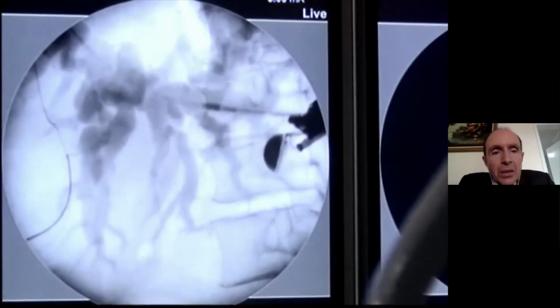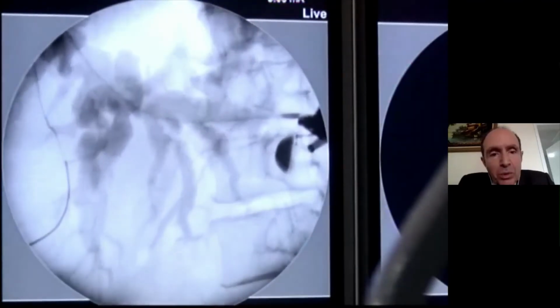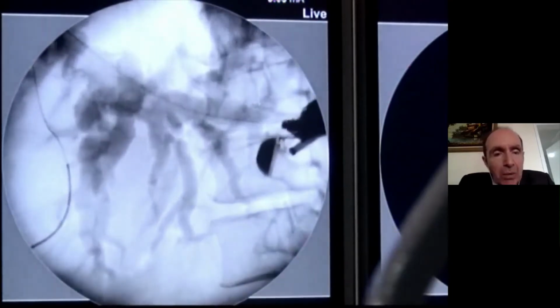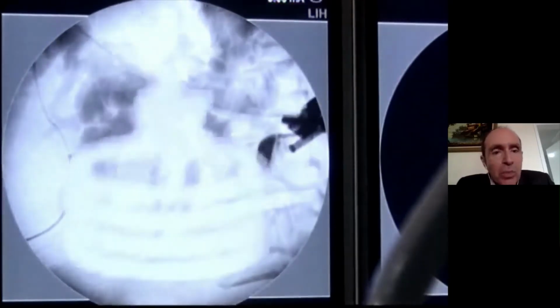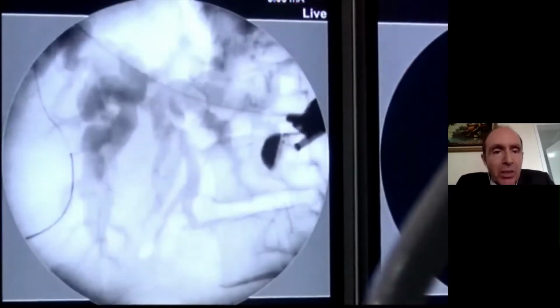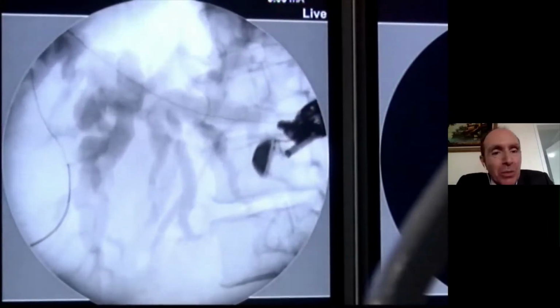Is the fluoroscopic image clear? Very clear. So this is one of the most challenging procedures in EUS, hepatogastrostomy. So I'm not going to keep asking you a lot of things because you need total focus with your team. Okay, so please take your time and do it nicely. I'm sure that's going to be a very nice demonstration.